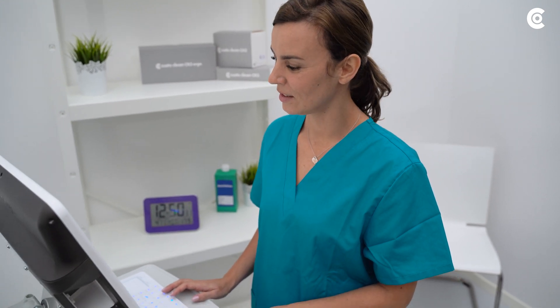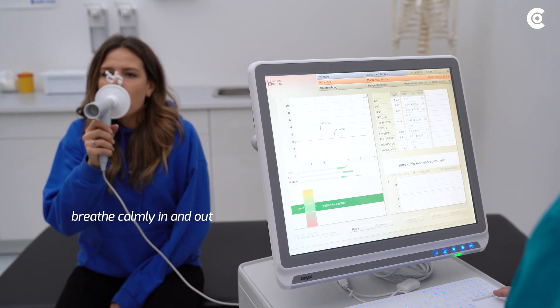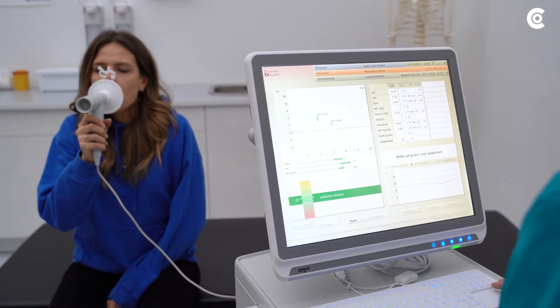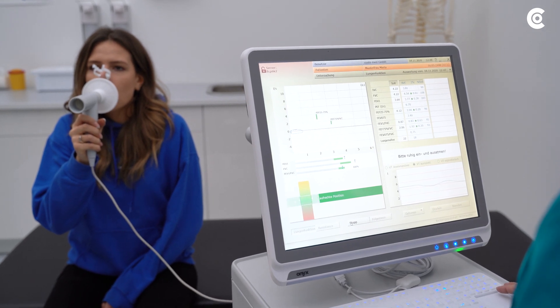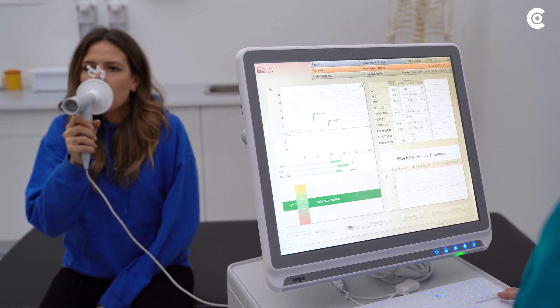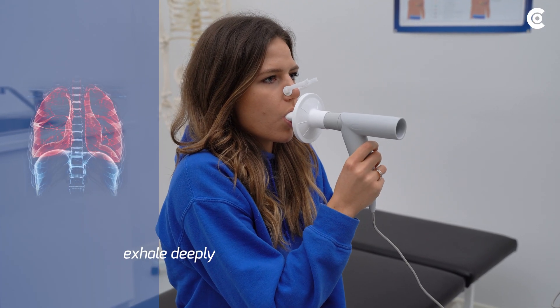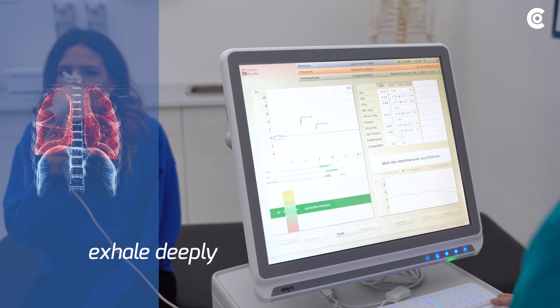Now start measuring the tidal breath. For this measurement, it is important that the patient calmly inhales and exhales several times. Just before the actual breathing maneuver, the patient must fully exhale in a long breath. Train the patient on this before starting the tidal breathing measurement.